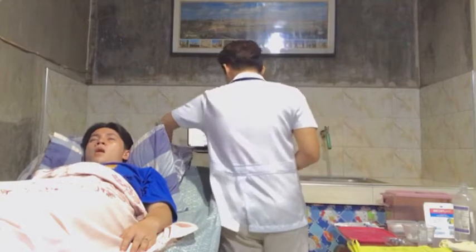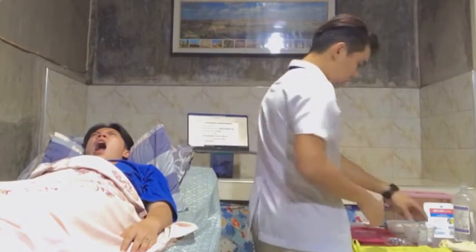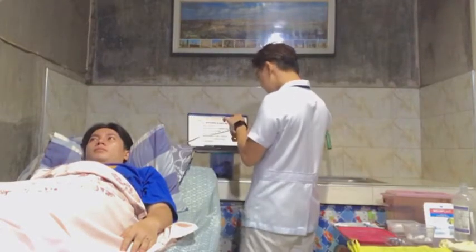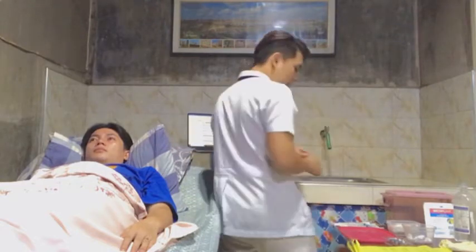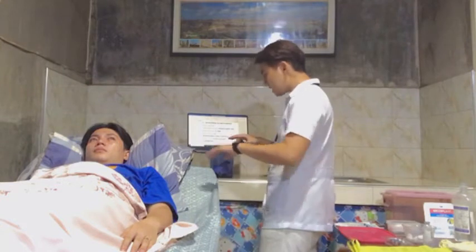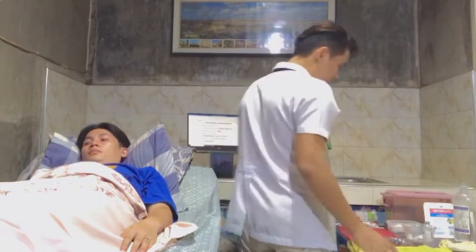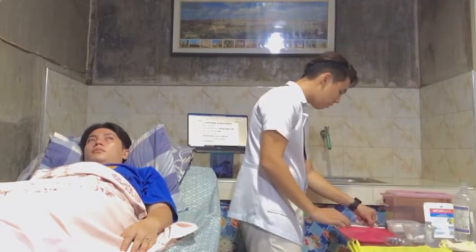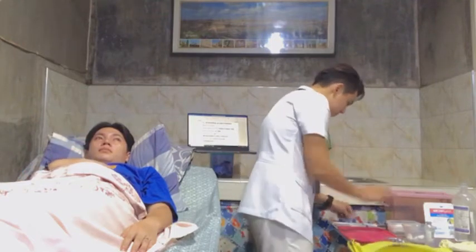Of course, we must log in first. And then the right medication is the paracetamol vial. The dosage is 0.75 ml, and the route is subcutaneous, of course. And the right time is 10 a.m. And now we can prepare the medication using, of course, a 1 ml syringe.